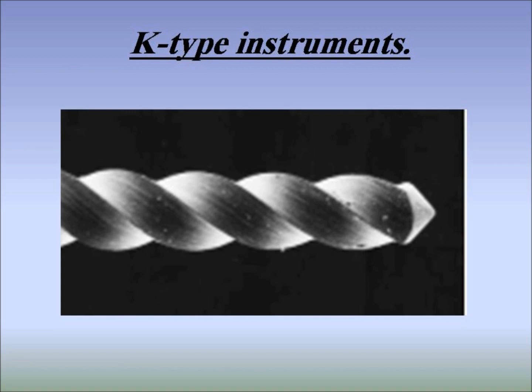Generally, reaming motion causes less transportation than filing motion. Transportation is the excess loss of dentine from the outer wall of the curved canal in the apical segment. As the instrument increases in width, its flexibility decreases.